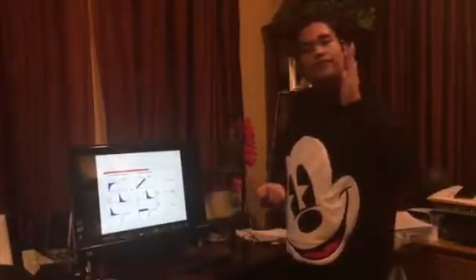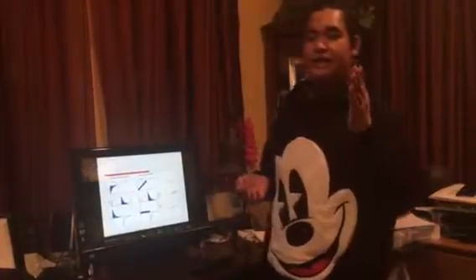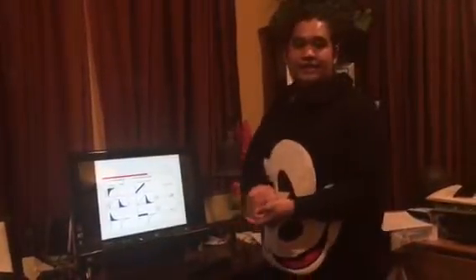As you can see in here, the pressure in pressure control is more of a square form, and for volume control, it's more of a shark fin. Now, why is it square in pressure control? It's because it's shooting up to that set pressure. When the patient takes an inhalation, it goes into that set pressure and stays there for a couple of seconds before cycling off to exhalation. So that's basically giving you more time having that pressure inside the lungs.